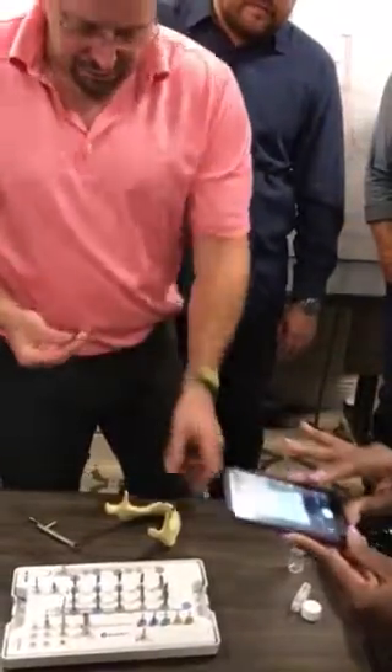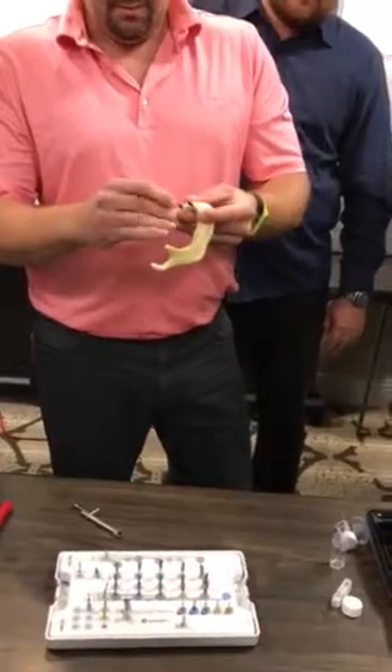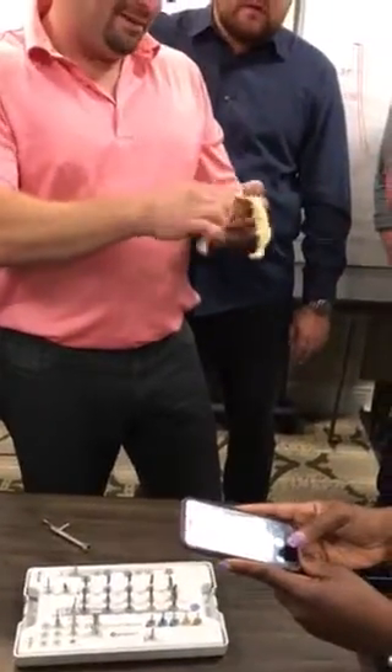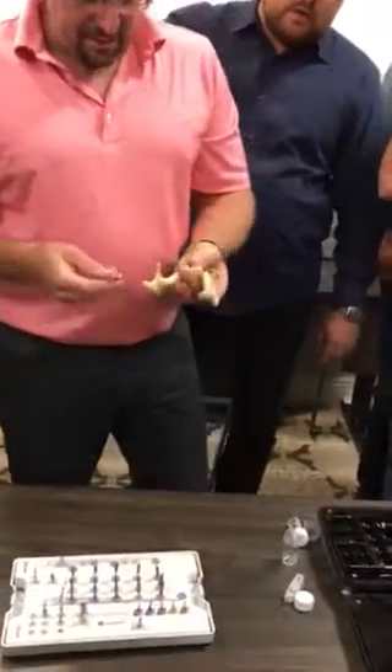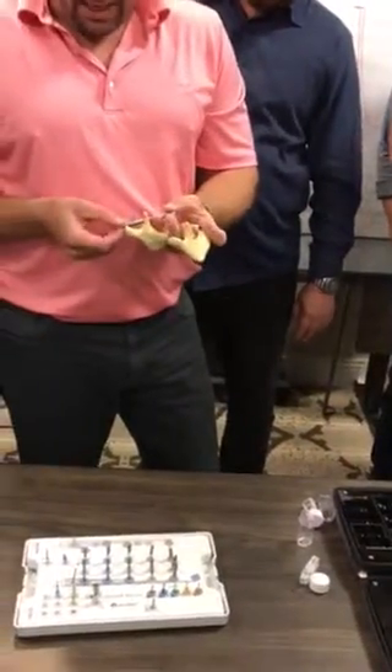This is a 4-3 drill. 4-3 implant — 4-3 by 11 and a half. Oh man, my hand's getting stripped. Stripped. Toughen up. Seriously. Soft hands, soft hands.